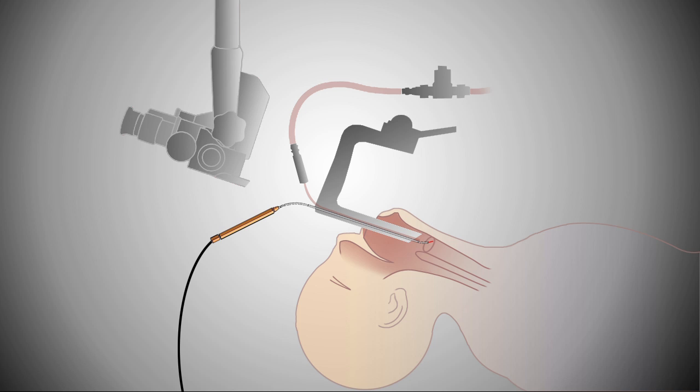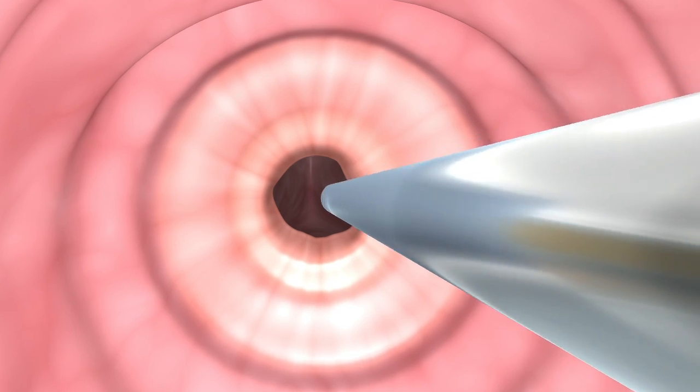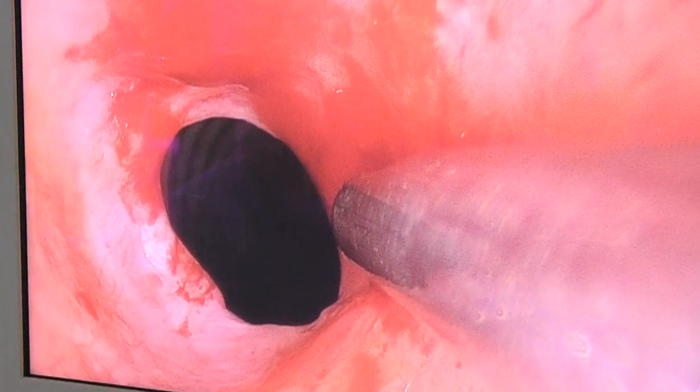The fiber becomes a more natural way to apply, a more facile way of applying laser energy. And the safety feature of having the OmniGuide fiber close to contact and a gas flow to remove the smoke of vaporization is a great benefit.